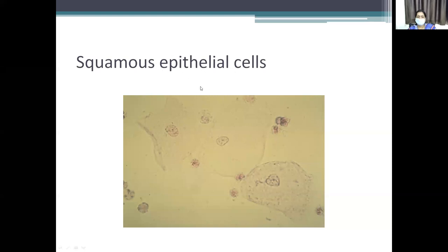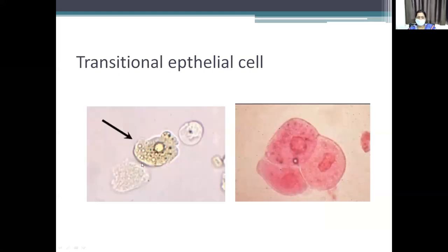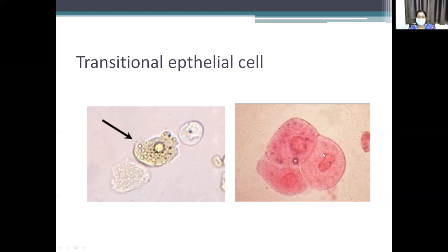Squamous epithelial cells are polygonal in shape with a visible nucleus. One or two are usually seen; if there are more, something is going wrong. Transitional epithelial cells can come from anywhere from the ureter and the urinary bladder. Any stone or obstruction can increase their number. In malignancy, these can appear as dysmorphic or dysplastic forms.